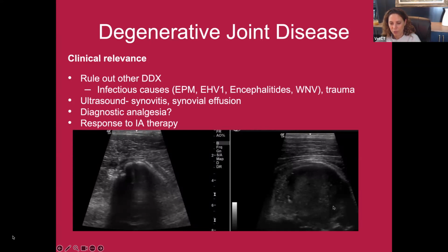And this view is a little bit more challenging. You're trying to angle your probe in long axis right down into the joint and get a view of the intracapsular view. But I think the best advice I can give is just lots of practice, trying to identify where they are. And this image is made with your probe in long axis, so the marker is proximally. I'm not sure what other advice I can say there, but I'll keep thinking about that.